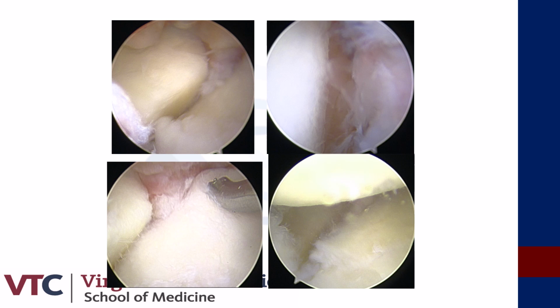We first placed the patient in a traction tower in the operating room. We performed arthroscopy of the wrist through a 3-4 portal and a 6R portal in the standard fashion. We debrided the radiocarpal joint, including some frayed edges of the TFCC. A significant amount of chondral debris was noted at that time. The membranous portion of the SL was disrupted and falling into the joint, and this was debrided.